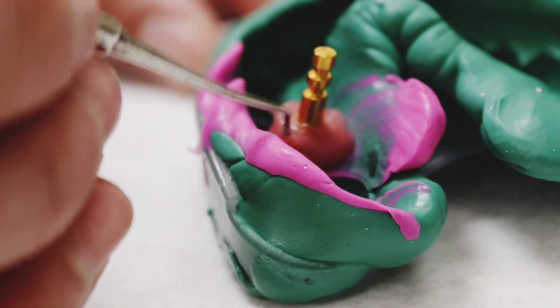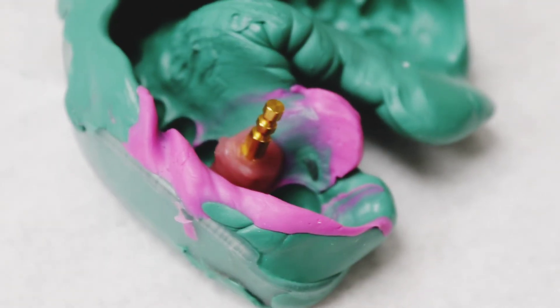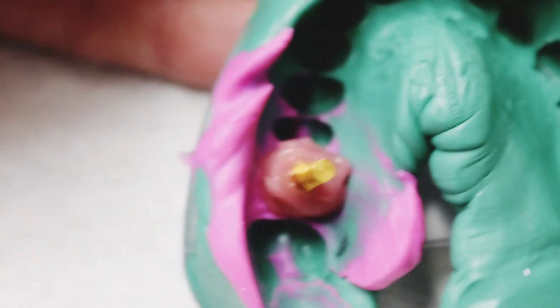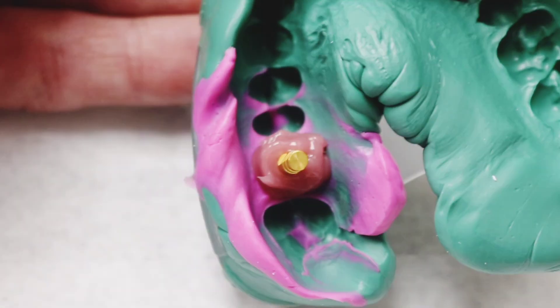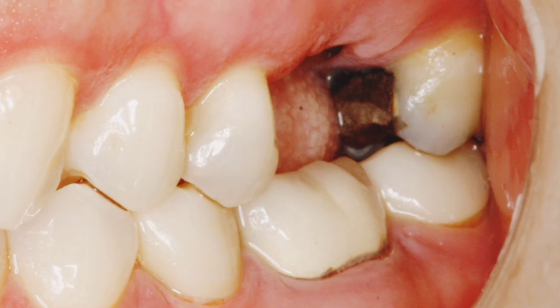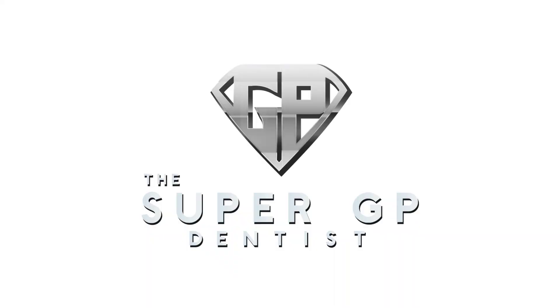I'll go back over and make sure the material is condensed and not touching the walls of the adjacent teeth. We let this set for a few minutes and it gets nice and hard. Your assistants or your lab can pour this up. You can use a stock abutment and prep it, have a custom abutment fabricated — whatever you want to create your crown. I typically use a stock abutment, prep it on the stone model, and send it to my lab for a zirconia crown. Here you can see the outcome — we had a missing tooth, took the impressions, the lab placed the stock abutment and cemented the crown, and we got a great result. The patient was thrilled.